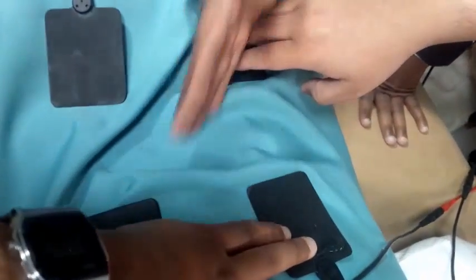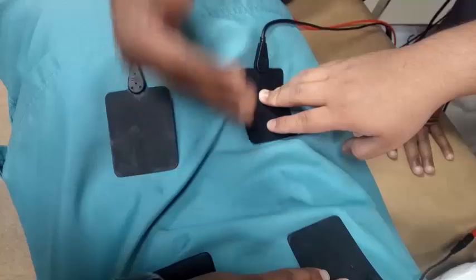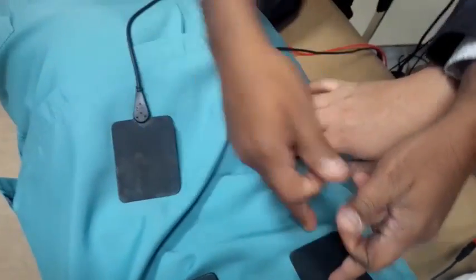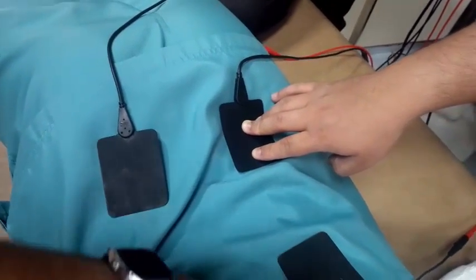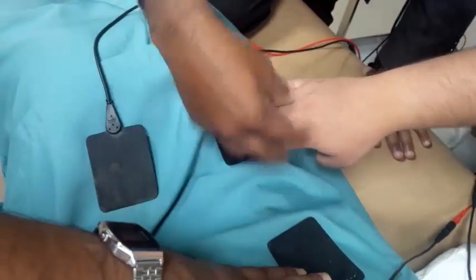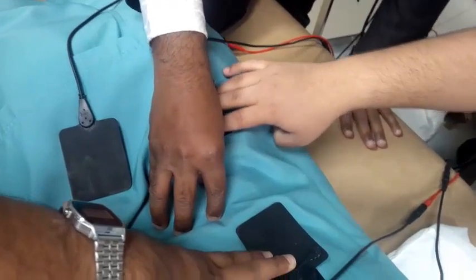This is channel 1, 4000 frequency, and here will be 3800 or 3900 frequency. So we are making 2 medium frequencies interfere with each other, so we keep it crisscross. We call this crisscross manner, or quadripolar arrangement. The current will be interfering and the effect will be produced at the center.